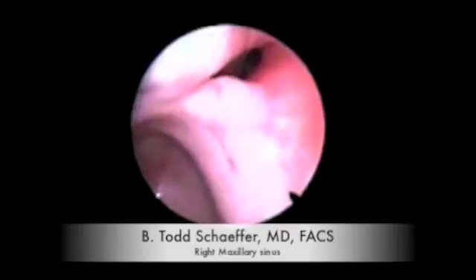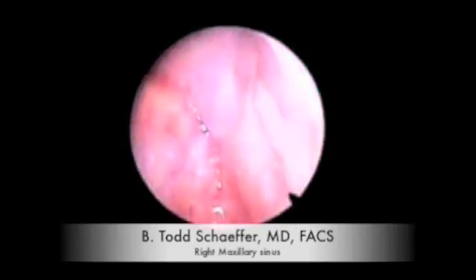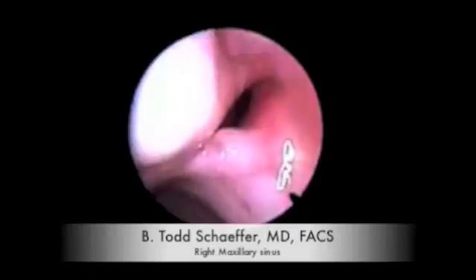An access sheath is in place to maintain access into the sinus. A 2.7mm endoscope, 0 degrees, is passed into the maxillary sinus to evaluate it. We see the ostium of the maxillary sinus in the superior medial posterior wall. It appeared narrow.